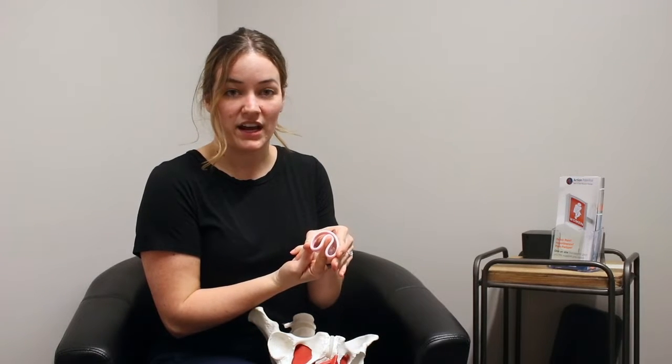In order to insert a menstrual cup, you'll do something very similar where you apply pressure on one end, bend and fold the cup so that it creates a smaller surface area.